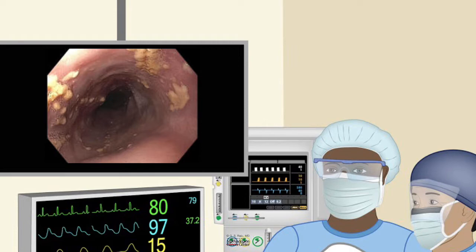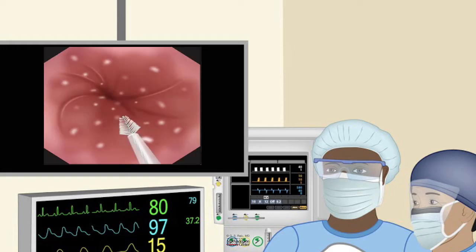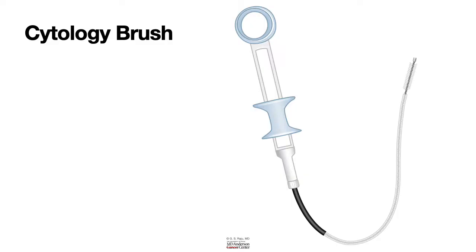So here we are in the esophagus of an elderly gentleman who has been on steroids, prednisone, for his asthma, and he comes in with difficulty swallowing and retrosternal discomfort. What you observe on endoscopy is esophageal candida or candidiasis. And one could establish the diagnosis either by taking biopsies from those yellow plaques or by using a brush cytology. So let us learn about cytology brush.